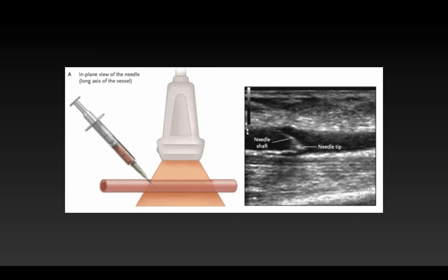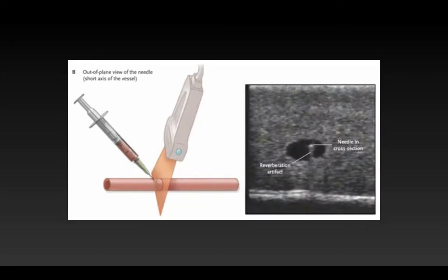For our approach, we'll be using one of two techniques. Here, we can see an in-plane view, which is probably more commonly used for placement of peripheral IVs — you can track the needle in-plane as it goes through the soft tissues and into the vessel lumen. More commonly with a central line, we'll use an out-of-plane technique. It's important when using this approach to step back an appropriate distance from your entry point in the vessel, and to move the probe and the needle tip forward, tracking it through the soft tissues into the vessel lumen.